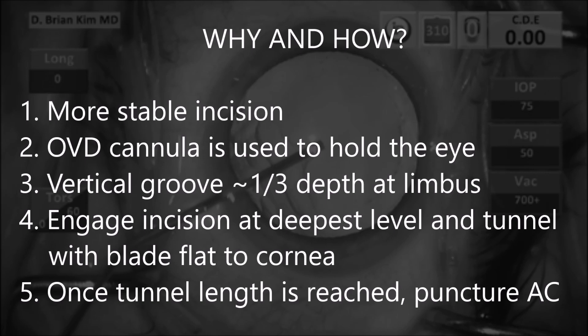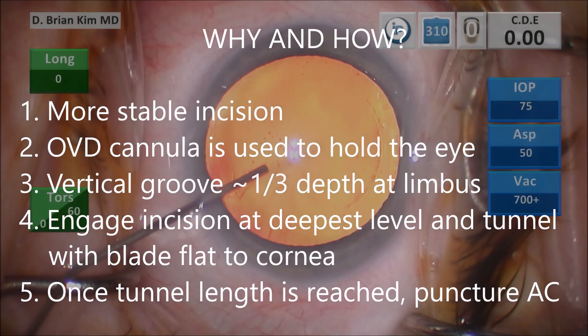How do I do this? After placing viscoelastic into the eye, you want to use a cannula to stabilize the eye. You create a vertical groove about one-third corneal depth at the level of the limbus, then you engage the deepest part of that incision and tunnel with the blade flat to the cornea. Once you reach the tunnel length that you want, you puncture through to the anterior chamber.